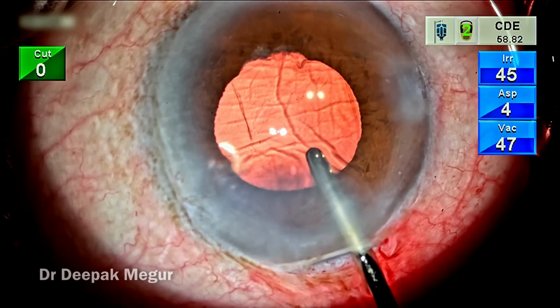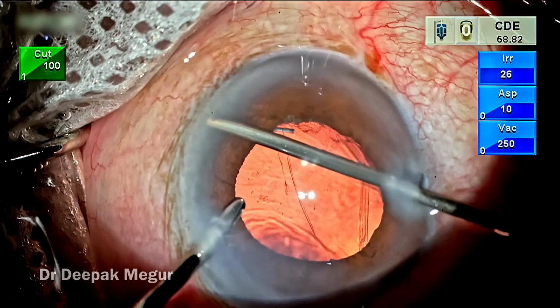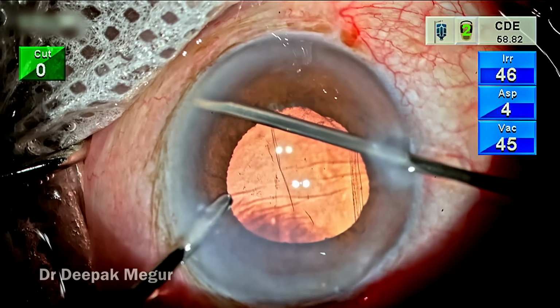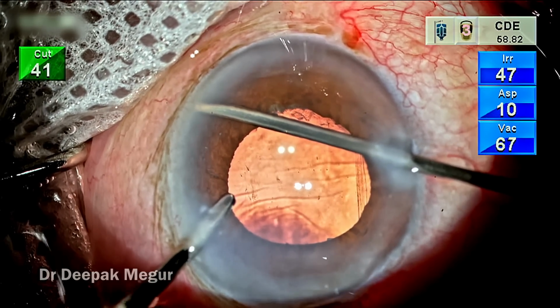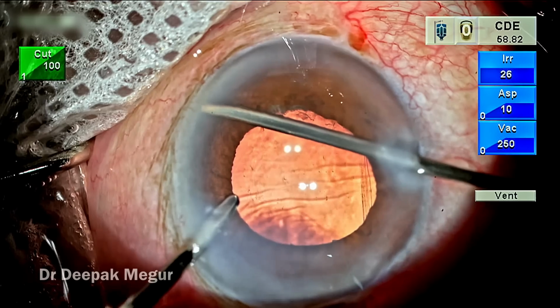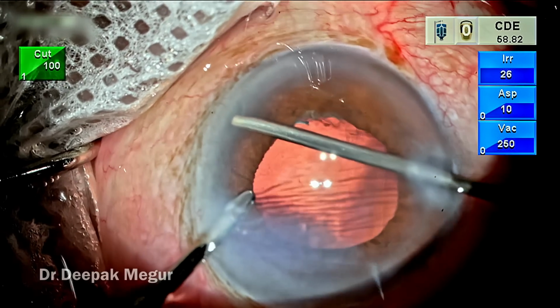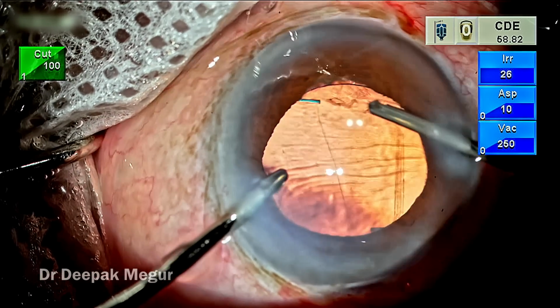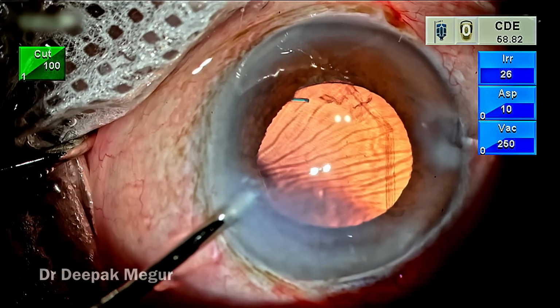It looks alright. In this particular patient, I'm also doing an iridectomy. It is not mandatory because we've already done a vitrectomy, but still, in situations where we place the lens in the sulcus and there might be some lens matter which can induce some inflammation, just to be on the safer side, I'm doing a peripheral iridectomy with my cutter itself.